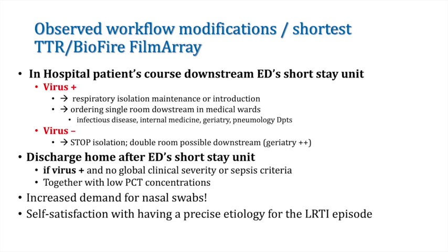The second consequence was that we ordered a single room downstream in the medical wards: infectious disease department, internal medicine, geriatrics, pneumology department. So practically, it was very important for us to have the confirmation of viral infection, to tell our colleagues in medical wards, this patient has a viral infection and we must maintain isolation.